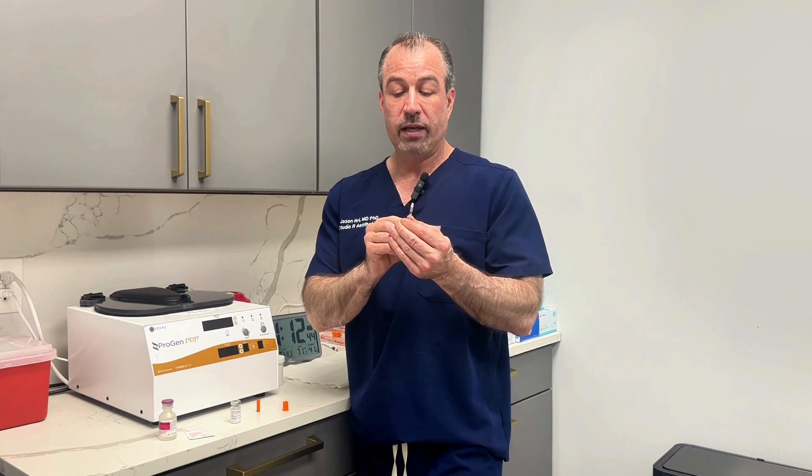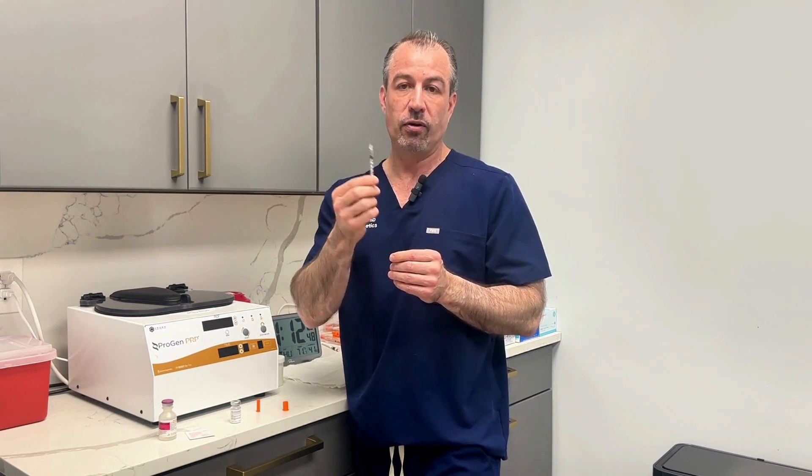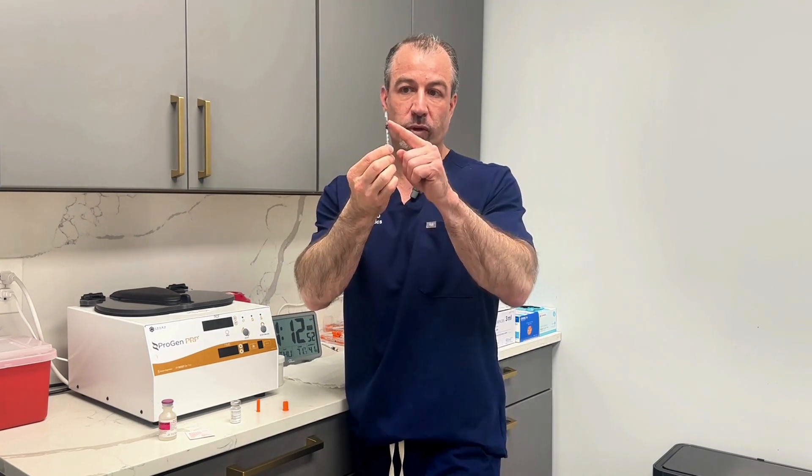You're going to pull back. If you're starting semaglutide, it's going to be 10 units or 0.1ml — 100 units per ml. You pull it back to the 10 on the syringe. It's a really, really tiny needle.